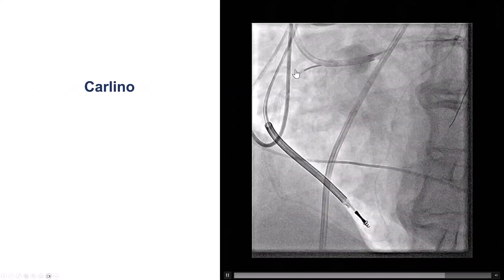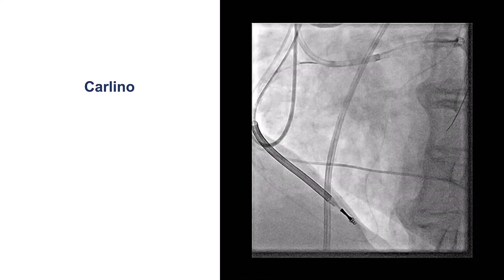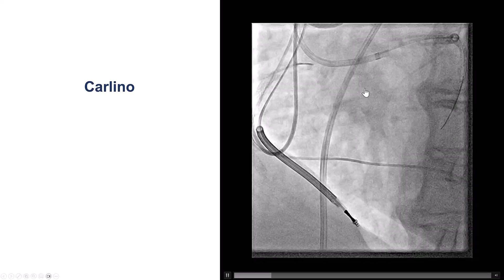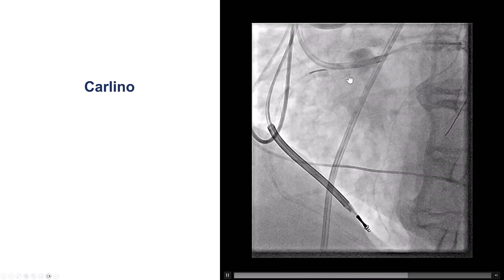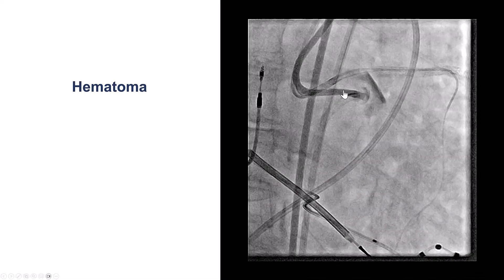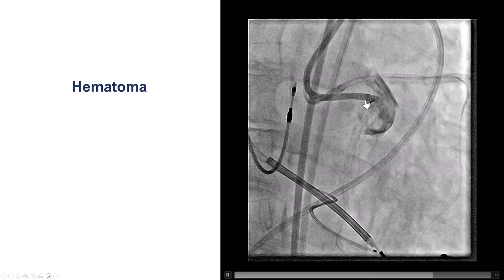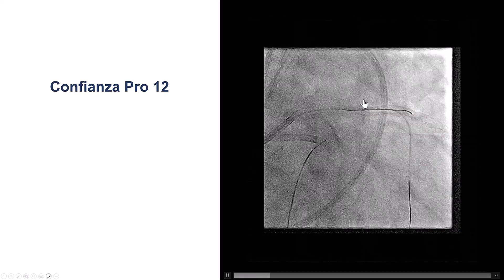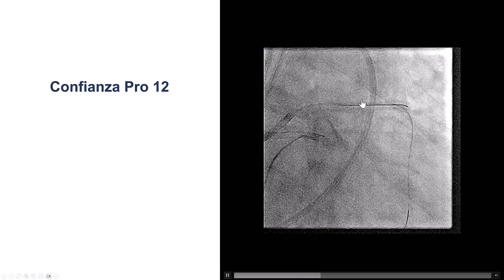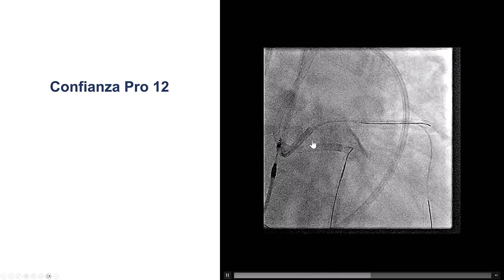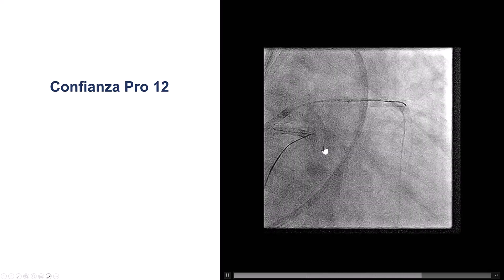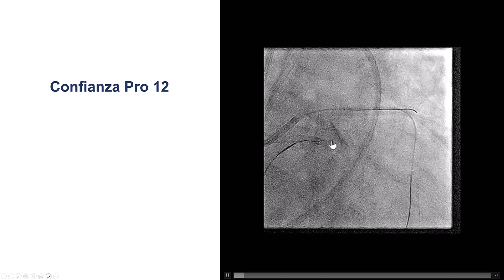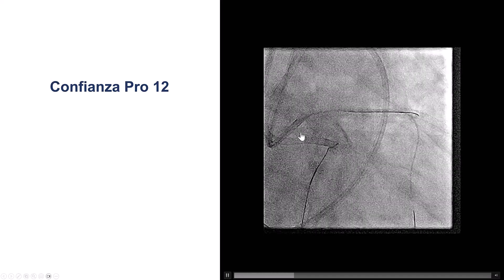We decided to use the Carlino technique with a small contrast injection, but unfortunately we had dissected in the sub-aortic space, so we have a little sub-aortic hematoma. This is how it looks on the RAO view. This can be a challenging situation — one can try different stiff wires trying to make the bend towards the left. We did try a Confianza Pro 12 wire, and eventually we were able to advance the Confianza Pro 12 into the aorta.